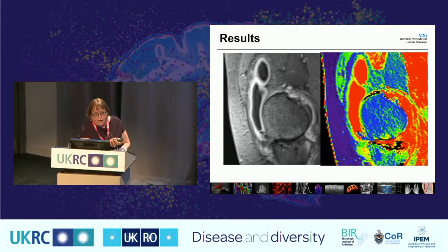And because this patient has got an osteochondral defect and has got bone marrow edema, when we give gadolinium, it enhances as well. So we can actually see there's some enhancement here, which is showing some of the degenerative changes that we have either in the femur or in the tibia.